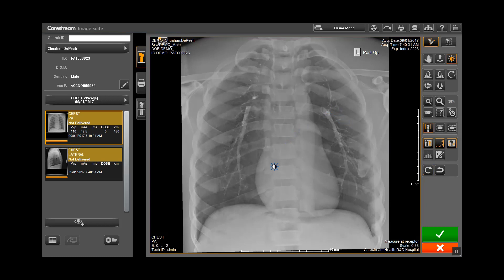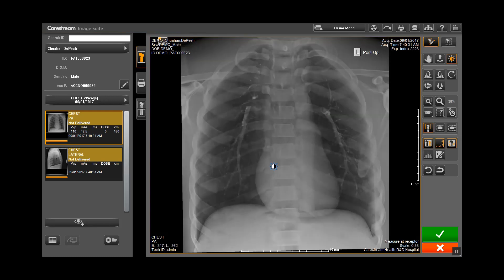Once you are satisfied with the changes, click on the accept icon.